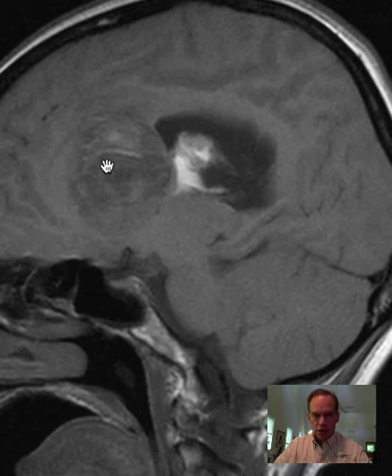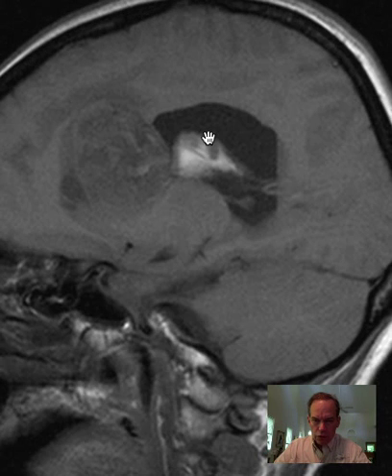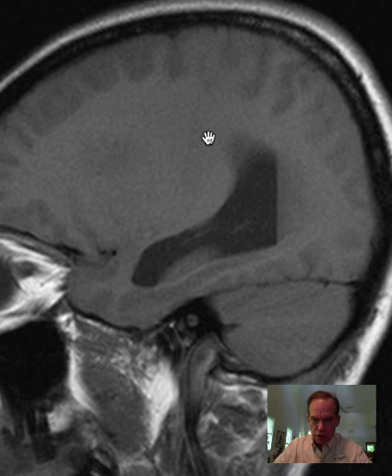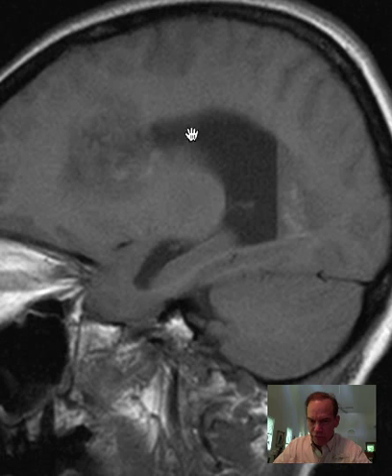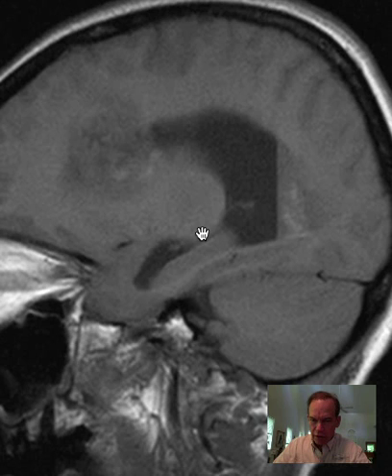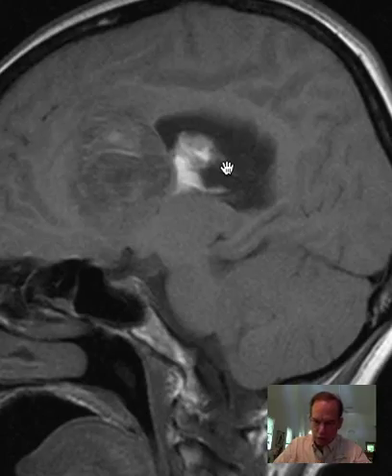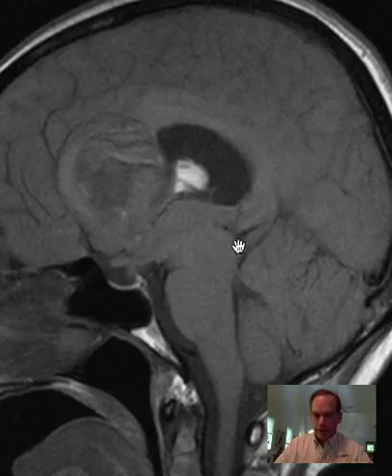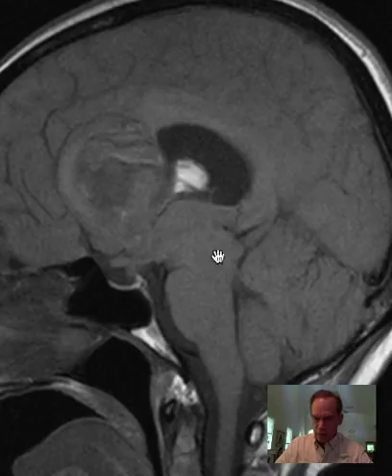Generally, these GBMs are so high grade that even brain that looks normal next to them is actually infiltrated with some of the cells from this tumor. Here is a sagittal T1-weighted image showing the same features. You can see the shape of the right lateral ventricle, the body of the ventricle, the atrium, the temporal horn of the right lateral ventricle, and the clot hanging down from the tumor within the body of the right lateral ventricle. Here you can see a nice depiction of the pons, where all the crossing fibers go to and from the cerebellum.